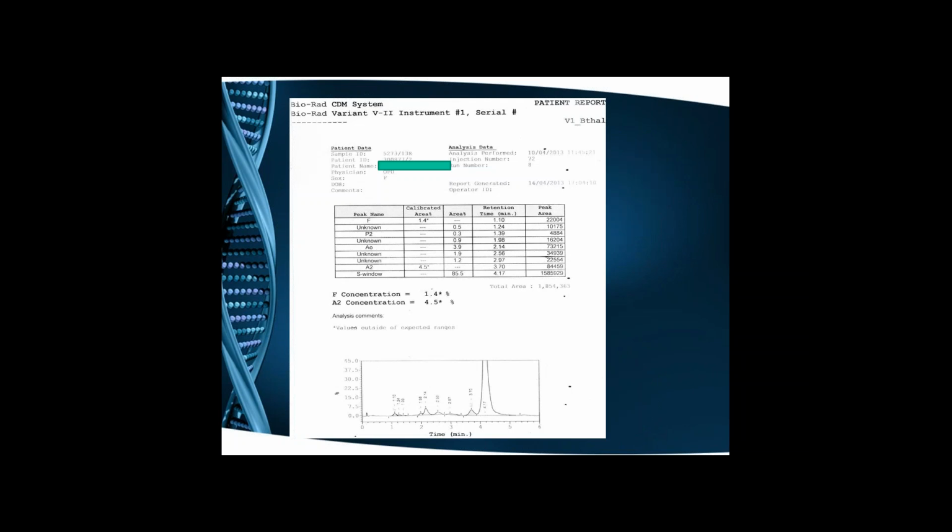So I'll give a brief history, then we'll look at the chromatogram, and then we'll look at the diagnosis. So this was a chromatogram from our hospital. Since sickling is very prevalent, when this lady came, she was a 45-year-old lady, a known diabetic.